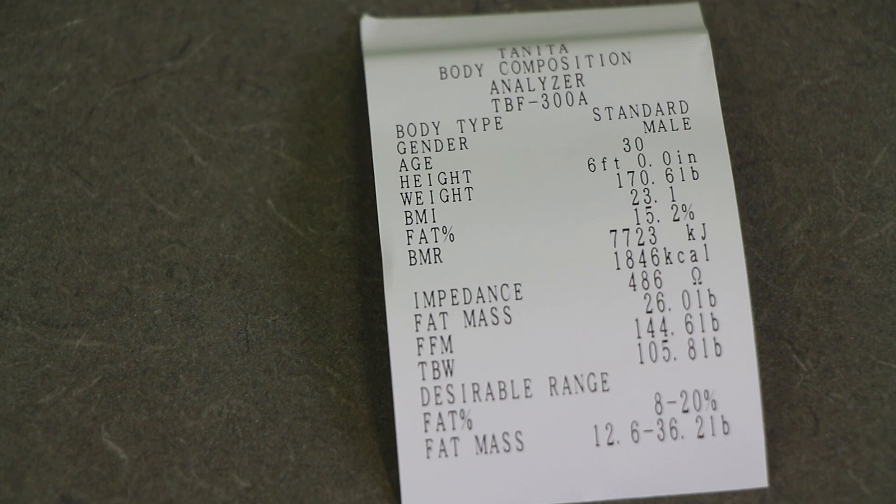Below that is the impedance — the machine works by sending an electrical signal through the body and measuring how much resistance to that flow of electricity the body gives; the more impedance, the more body fat. Then we have fat mass in pounds, fat-free mass in pounds, and total body water weight also in pounds. Below that, the machine gives you a desirable range for that individual both in fat percent — 8 to 20 percent for this individual — as well as how many pounds of fat that would be.